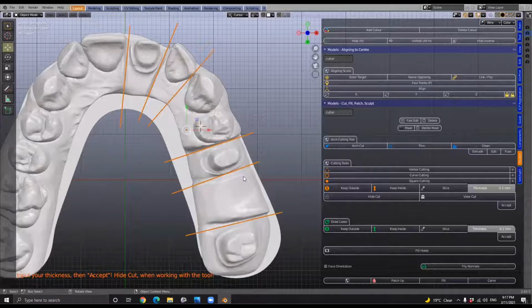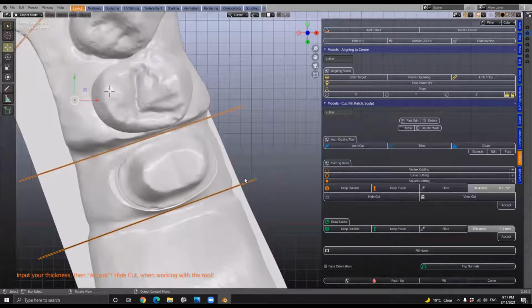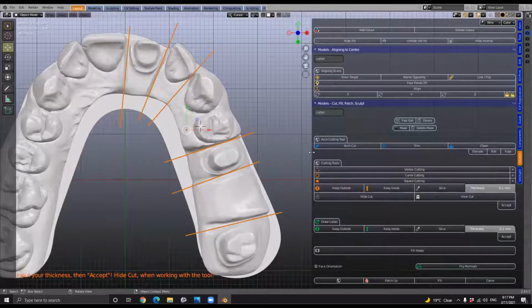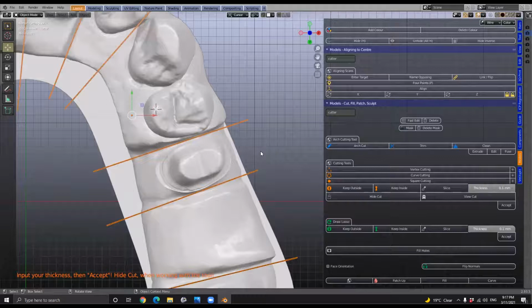But you can appreciate that if we've got a burn layer on the underside of the die, the burn layer will not only protrude like a swelling on the buccal and the palatal side, but it will also give you the swelling of the resin on the mesial and the distal side, which means if the slice is too thin, the burn layer will interfere, each die will interfere with the other. And we'll show you what to do.